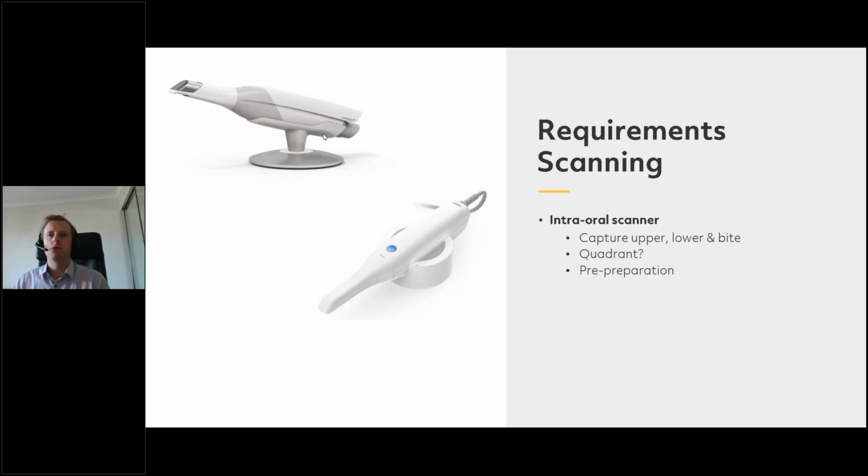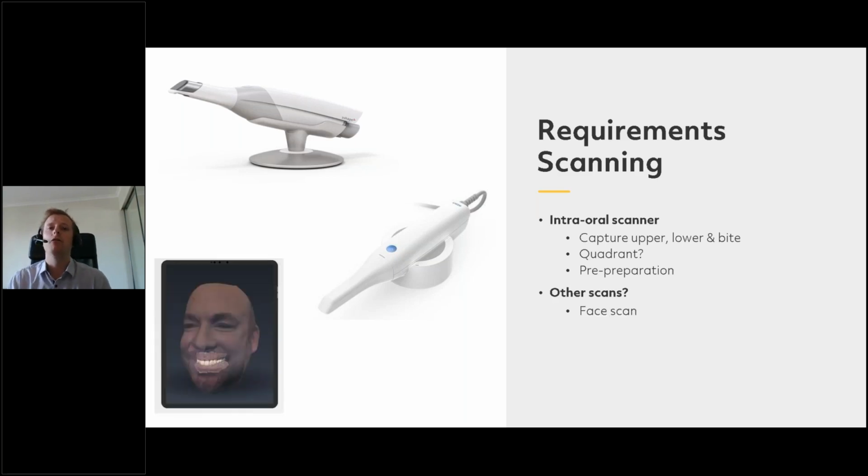And being 2020, there's always new things to talk about, and I'm talking about other scans. Face scans are a huge part of dentistry now. You may have an iPad with the Bellus 3D app where you can pick up your phone and take some photos with that or swing it around you. And that way you can get a 3D face scan, which you can then align to the teeth and show the patient this is what your teeth could look like. This is extremely popular now with digital dentures in the lab, and of course with smile design for aesthetic cases, it's becoming very popular as well. So it's worth considering maybe investing in a 3D scanner that is stationary like a Bellus or a Face Hunter or many other brands, or getting an app that will do that for you.